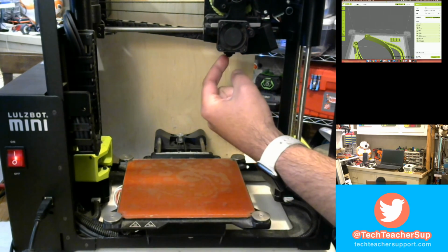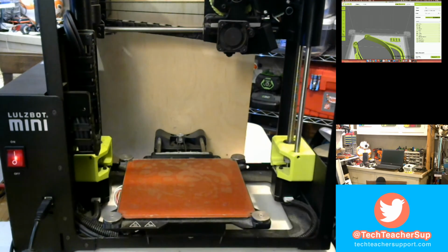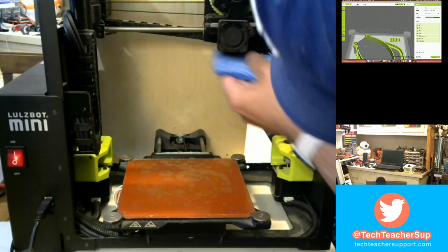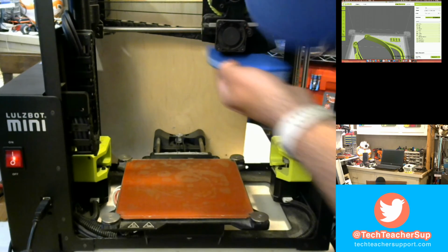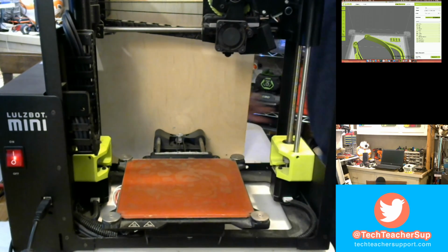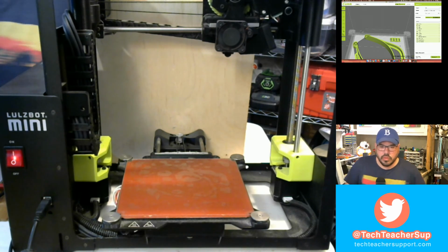And then also I'm going to go up to the nozzle up here and break off this piece of plastic and give that a nice little scrub as well to make sure it's ready to go. Okay, that's it. So we are ready to go.